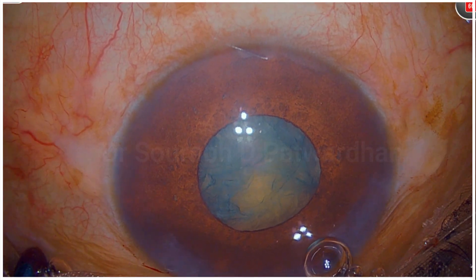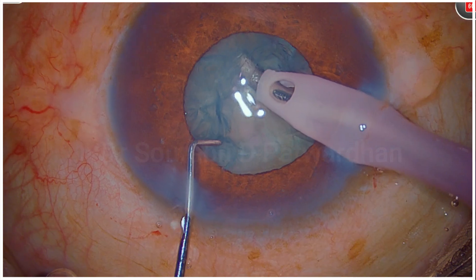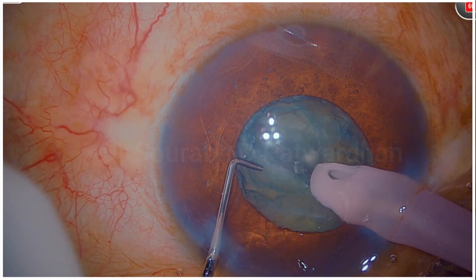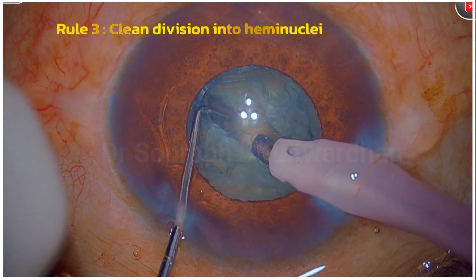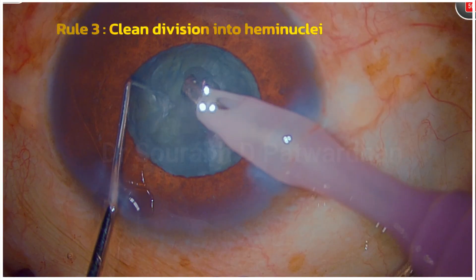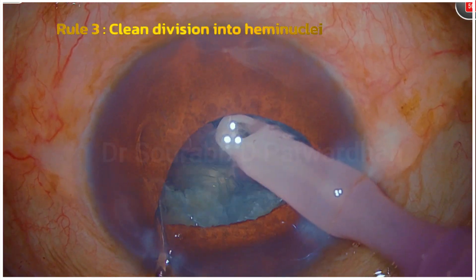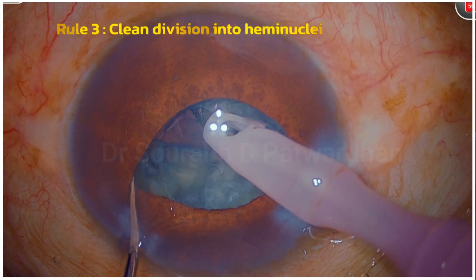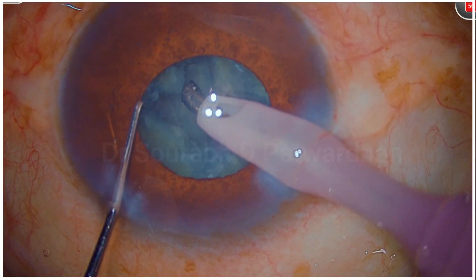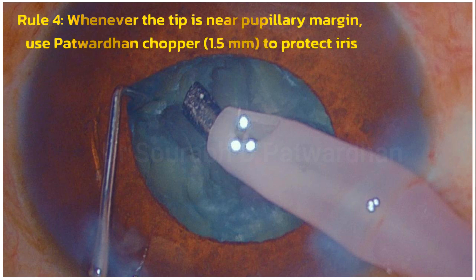When I start doing phacoemulsification, remember the first aim is to have a very clean division into two halves. A deep trench with horizontal positioning of my Patwadhan chopper — I will also link the video where I show exactly how it has to be placed at the depth of the trench to achieve complete division. You can see the division is complete; the red glow is clearly visible when I separate the pieces. The moment I start quadrant removal, my Patwadhan chopper at 1.5 mm is there to hold the iris back because I am going to use high vacuum near the pupillary margin.